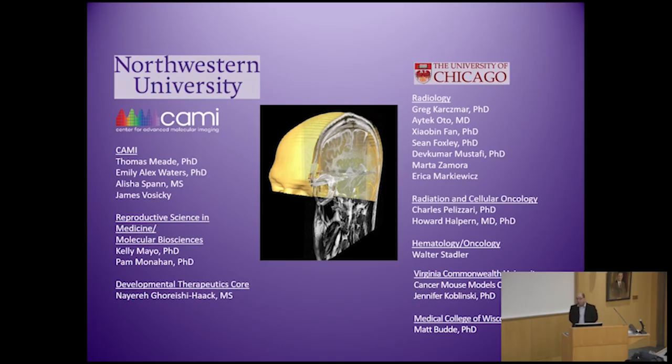Yeah, so for permeability of the vasculature, you need to use a contrast agent, and you do kinetic modeling of that to give you an idea if it changes in permeability. So there's gadolinium-based contrast agents. They're clinically available. So in those models, we use the same contrast agent that's used in the hospital. Yeah. So the key to that is you image really fast, and you do kinetic modeling of the curve, gadolinium versus time.